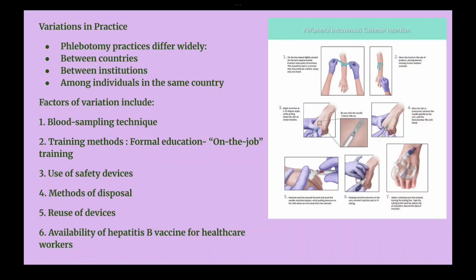Firstly, the blood sampling technique may be different in different hospitals and different places. The training method taught to people in the healthcare profession is different in different institutions, and the use of safety devices might also differ.